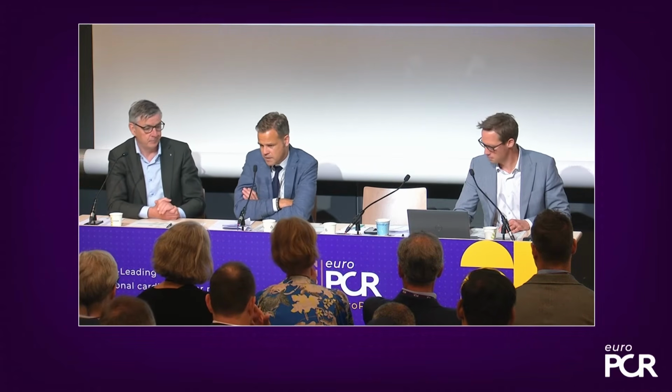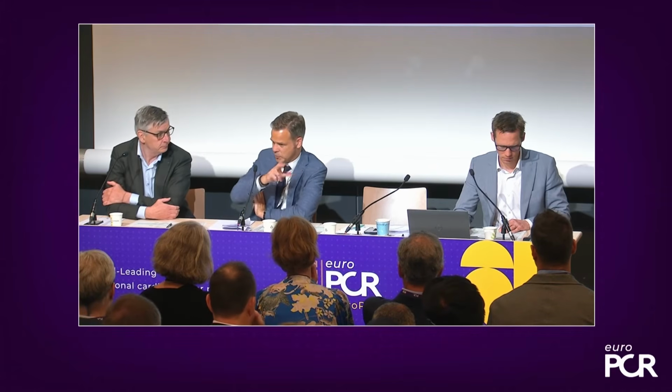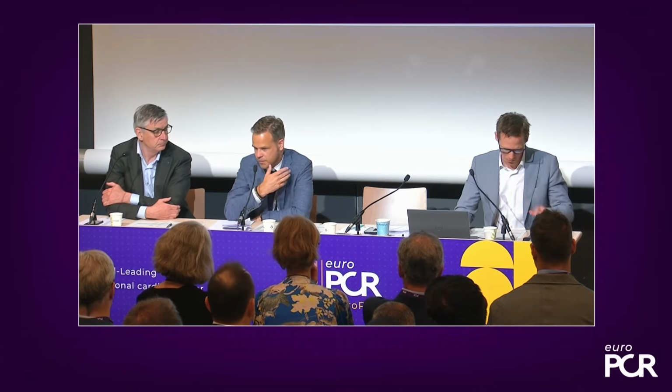No, I agree. With ICE, it's frequently difficult to do a full sweep, which we can do with the TE probe around the device. And now by simply having a 3D modality looking en face on the device, of course, you can easily see how the device has landed in the LA, but also the peri-device leak is much easier to see in an en face view. So I think it will definitely be beneficial to move this way.